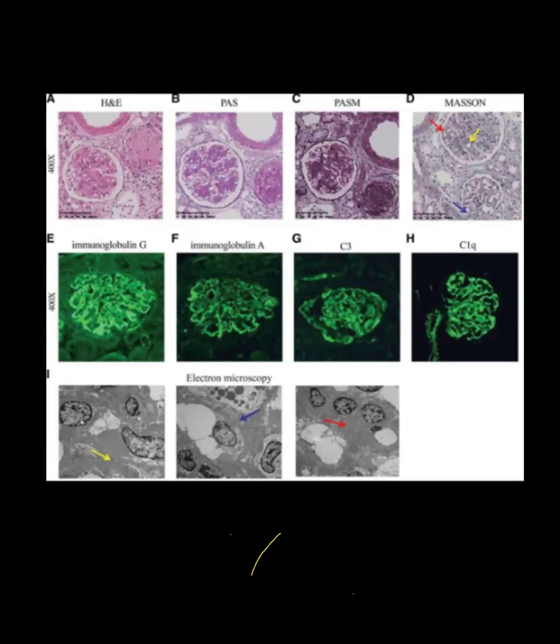First of all, in nephrology, you know that in light microscopy, we are using it to check the glomeruli, tubules, the interstitium, the blood vessels, the cellularity, the crescents, the necrosis, the sclerosis, the glomerular basement membrane thickness, mesangial expansion, endocapillary proliferation, as well as exocapillary proliferation of the crescents.